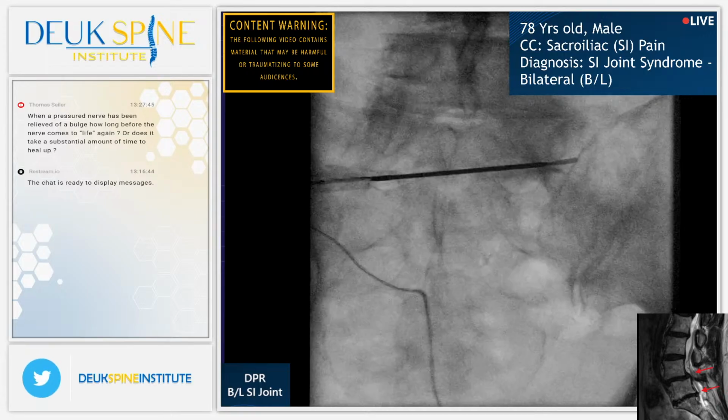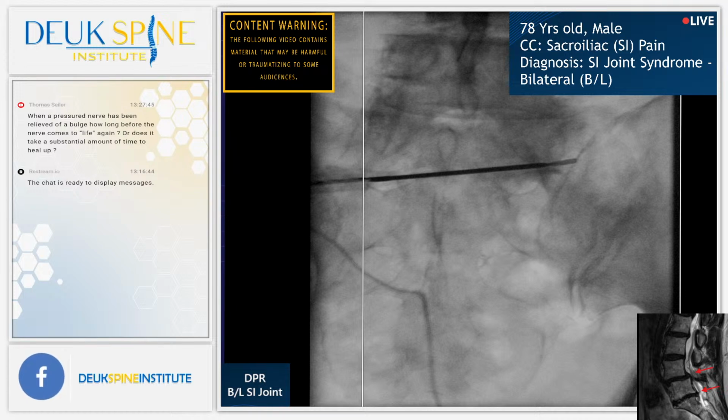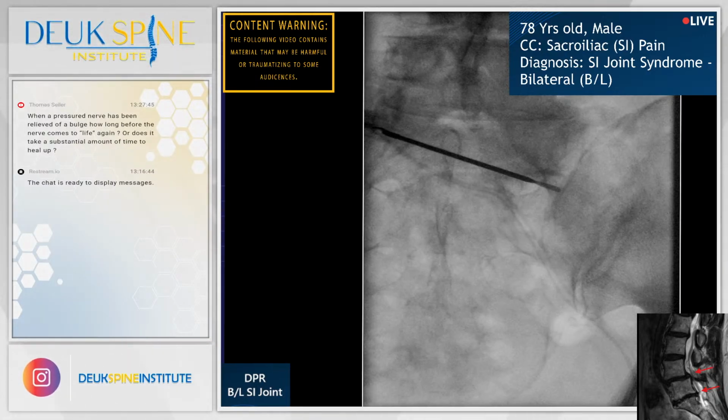Shot. That's good. Yeah, that's the top part. Feels good. Got in there. You can feel the crunchiness of that calcified ligament. Got to go through it. Shot. Got to get to the deep part. The deep part's where those nerves are. And that's what I told them. I was going to go as deep as I can go. All right, so I'm going to go south a little bit. We're almost done. About 2 more minutes.